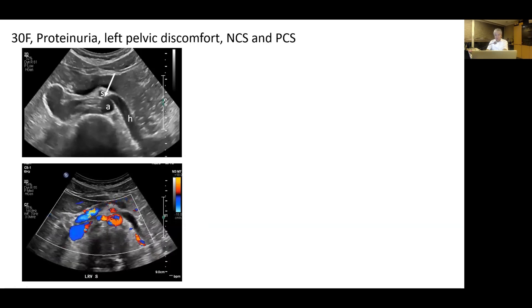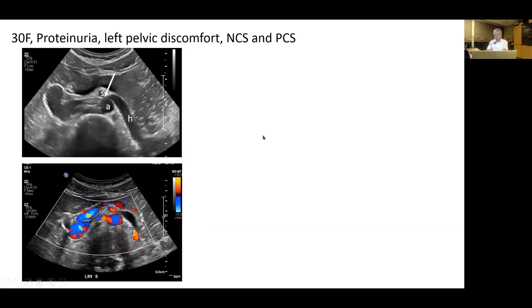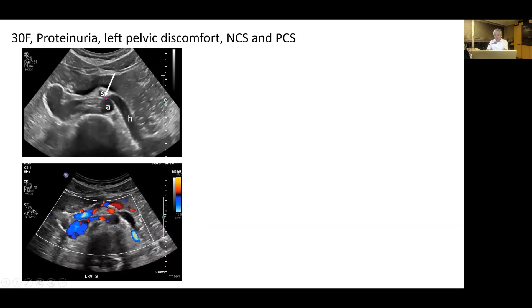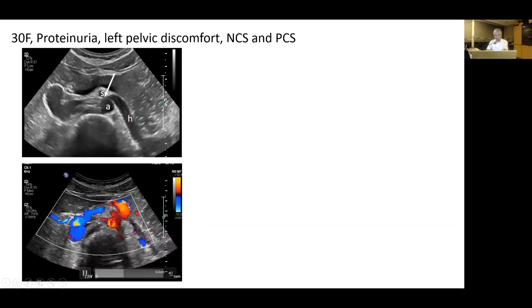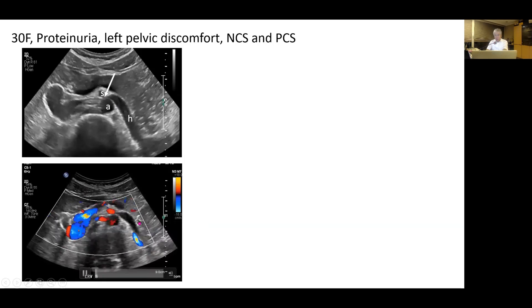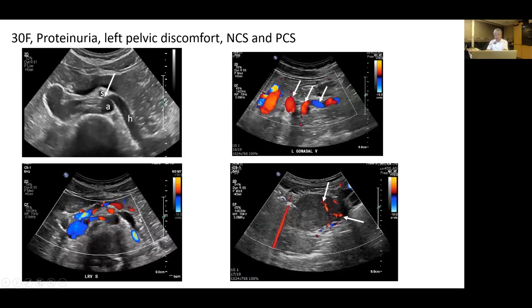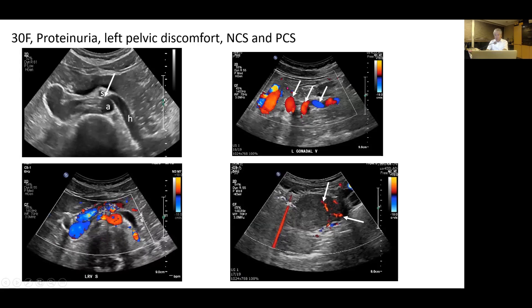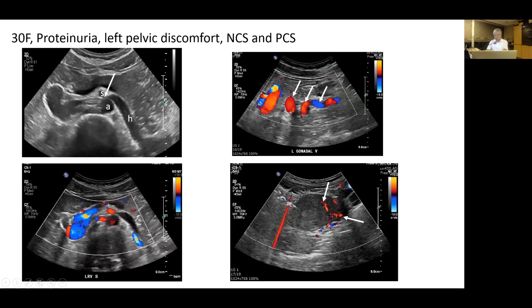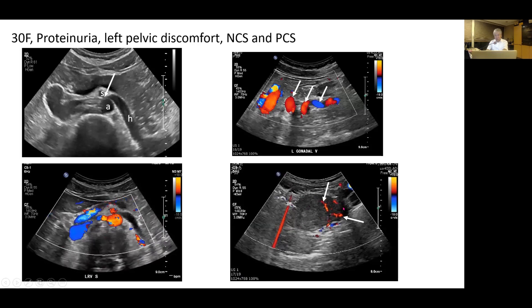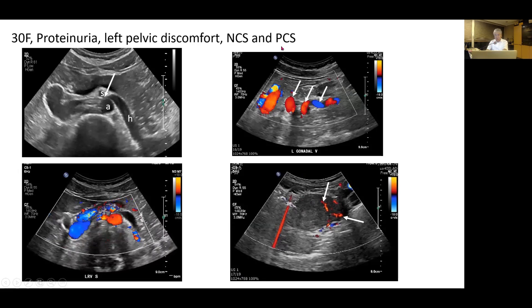A 30-year-old woman with proteinuria and left pelvic discomfort: ultrasound shows compression of the aorto-mesenteric left renal vein and dilated hilar left renal vein. Transverse ultrasound of the uterus shows left-sided pelvic congestion. This patient has both Nutcracker syndrome and pelvic congestion syndrome.